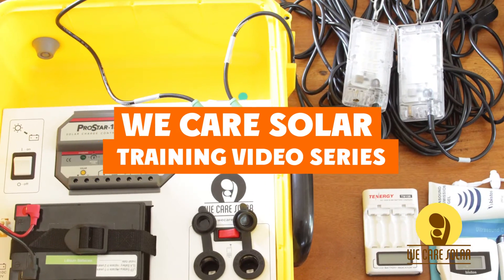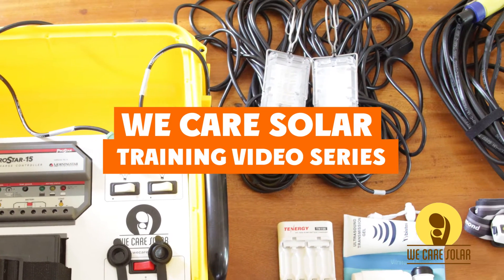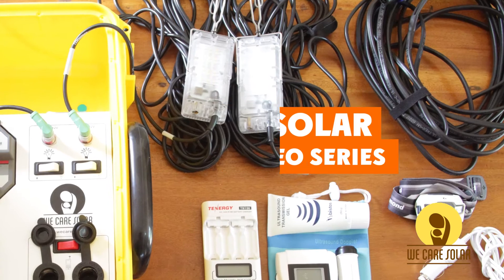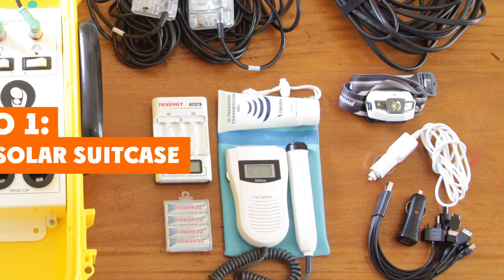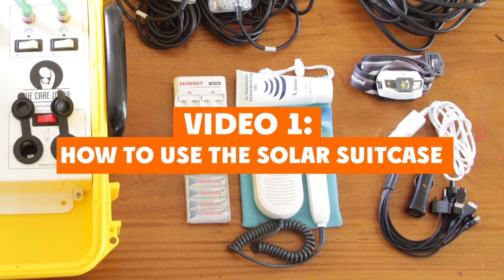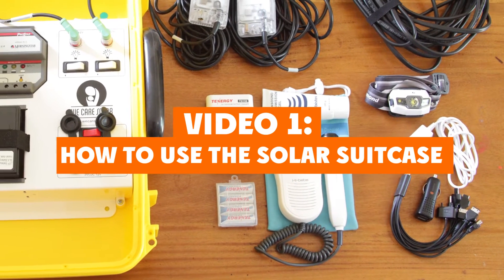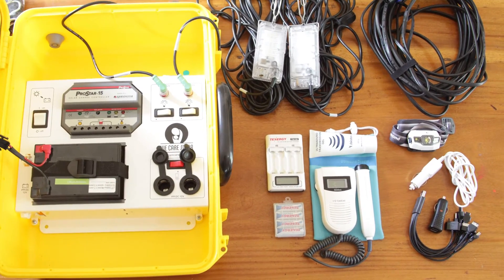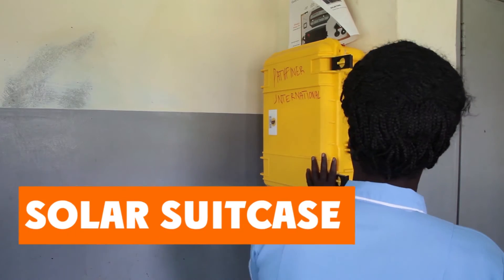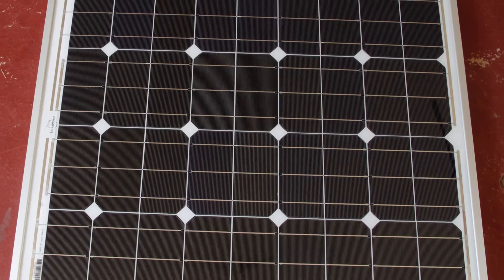Welcome to the We Care Solar training video series. The solar suitcase is a complete solar electric system that powers medical lighting, mobile phones, and small devices. This video will teach you how to use the solar suitcase and its accessories. Before I show you how the solar suitcase works, let's open it and find out what is inside.